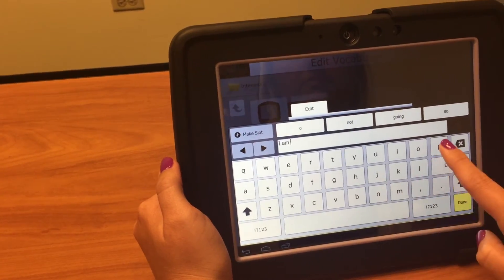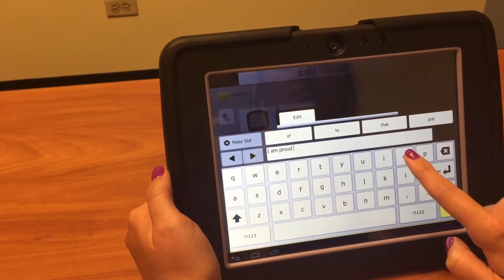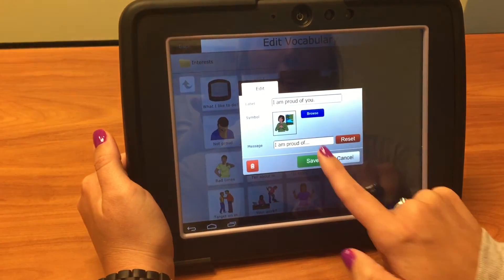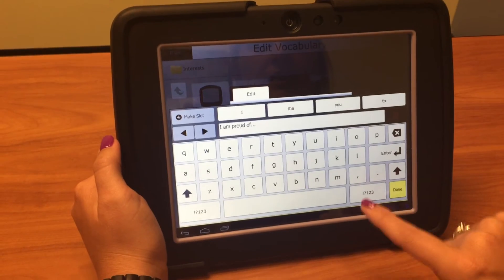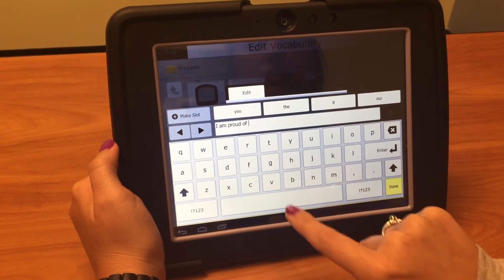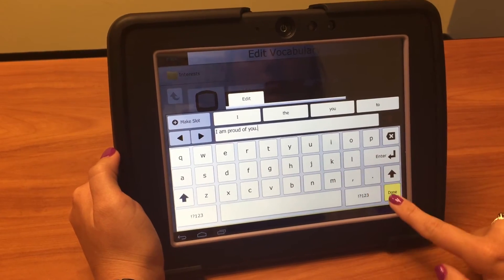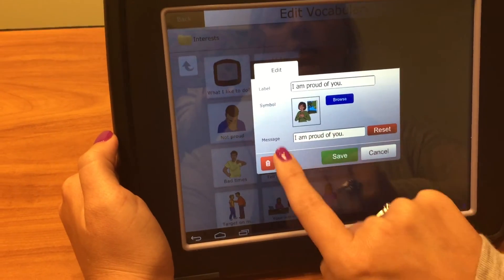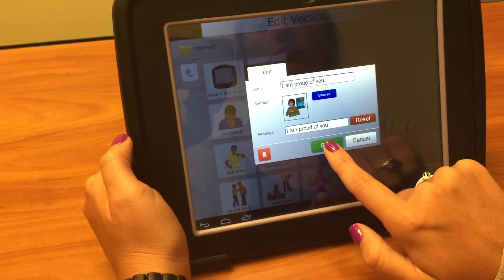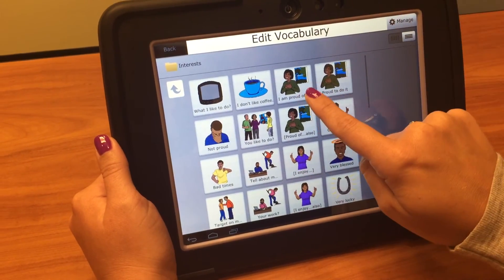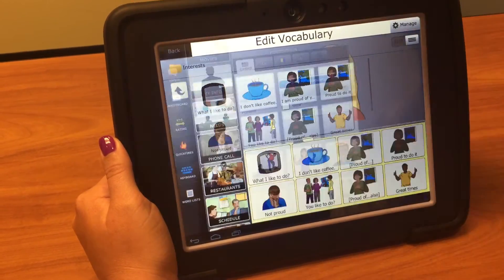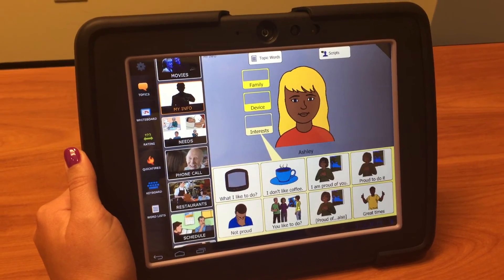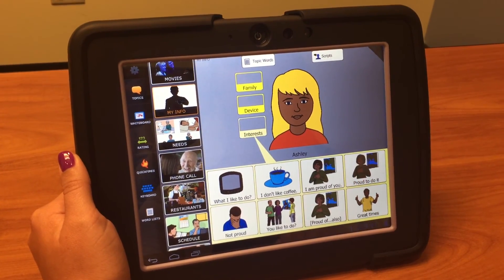For example, 'I am proud of you.' This is the message it will say. We have the label — that's what it will say on the button — and then the message is what it will produce. You hit Save. Now the button is updated. Go back, and if you just click outside of this box you're now out of modify mode. Here's the button: 'I am proud of you.'